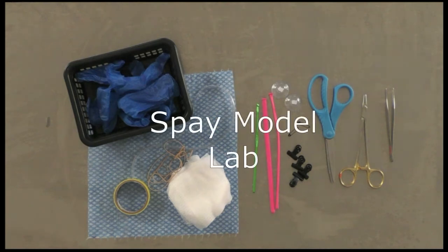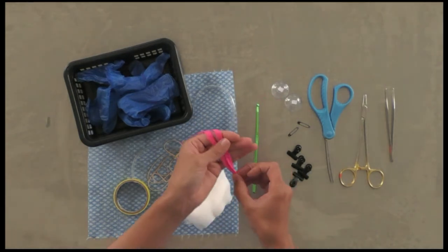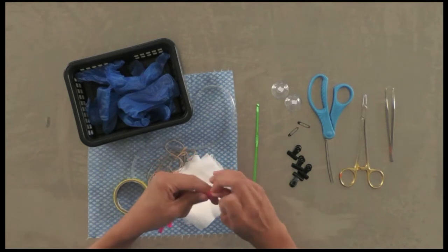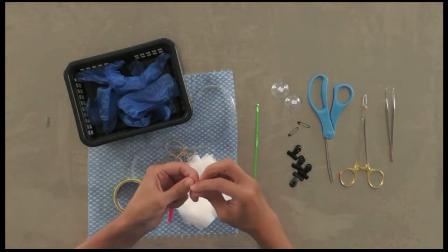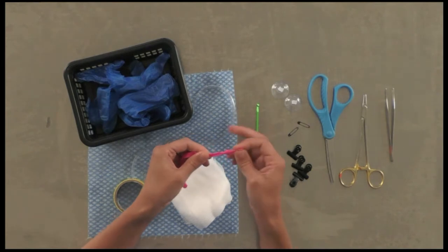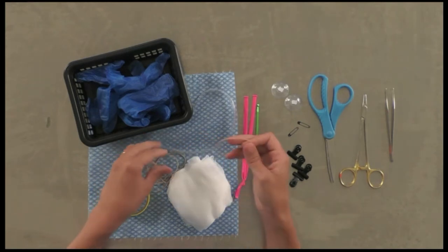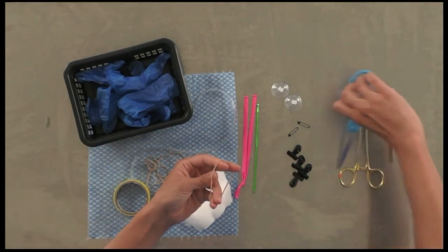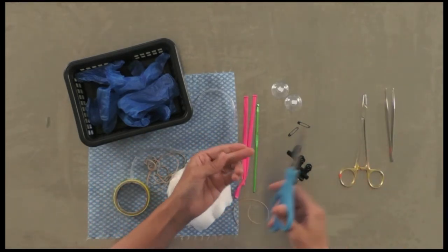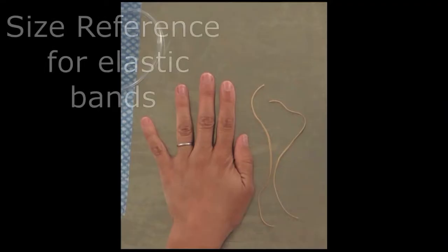Take your two long balloons and make a knot in the closed ends about a centimeter away from the end. Then take an elastic or rubber band and give it a snip — this is just a size reference so you know how big that should be.